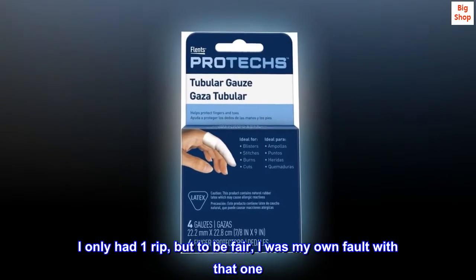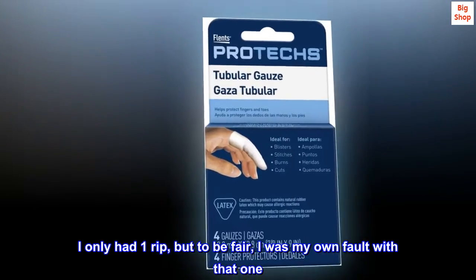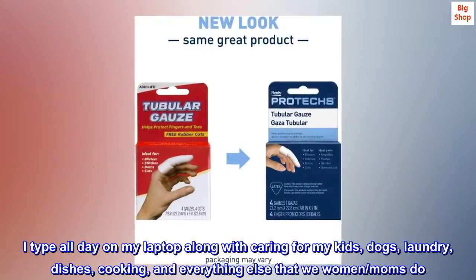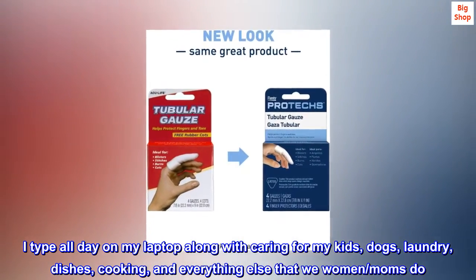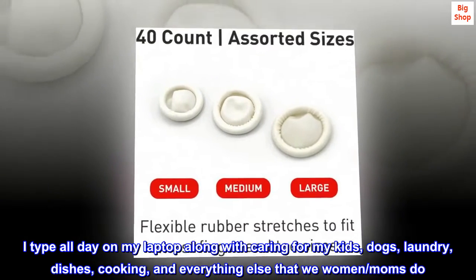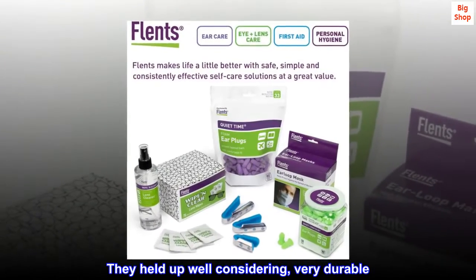I only had one rip, but to be fair, it was my own fault with that one. I type all day on my laptop along with caring for my kids, dogs, laundry, dishes, cooking, and everything else that we women and moms do. They held up well considering — very durable.